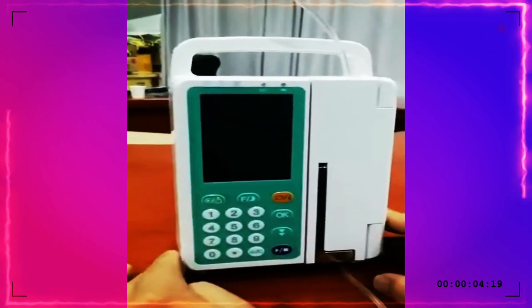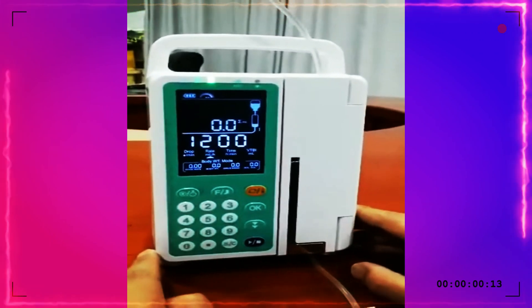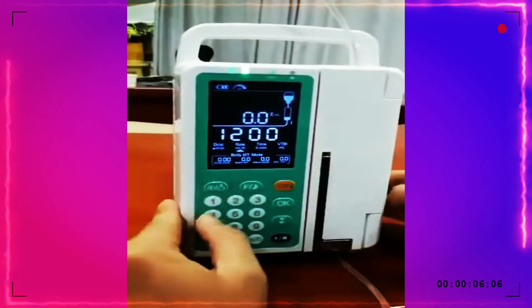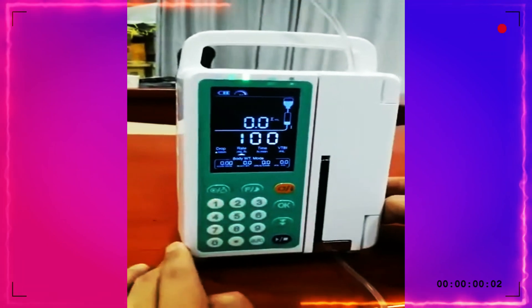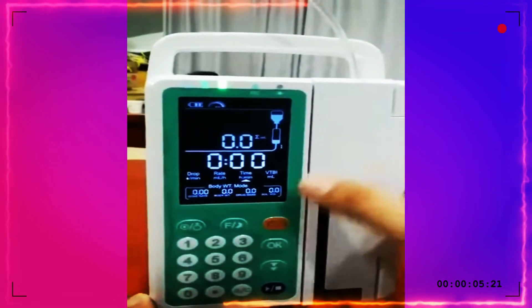Press this button to turn on the infusion pump. You can set the parameters by the keypad. For example, we set the flow rate to 100 ml per hour. And press this one to select the VTBI or time.